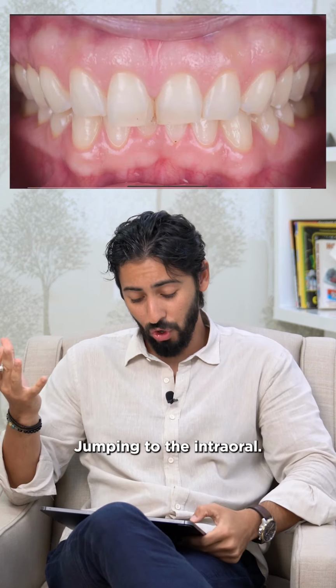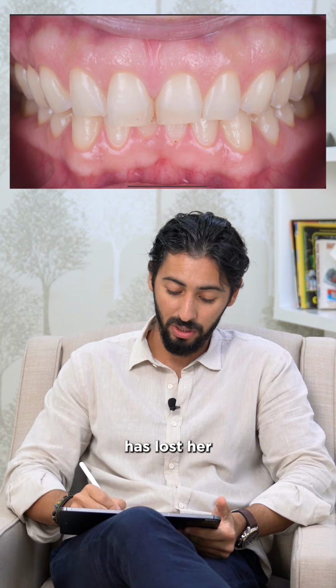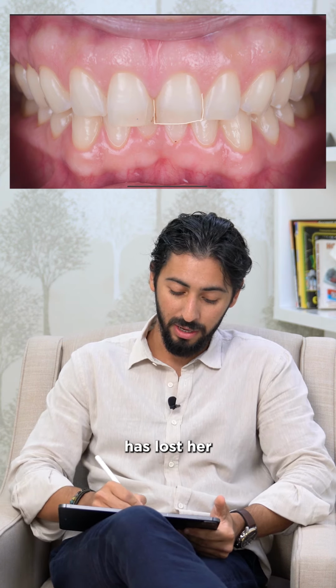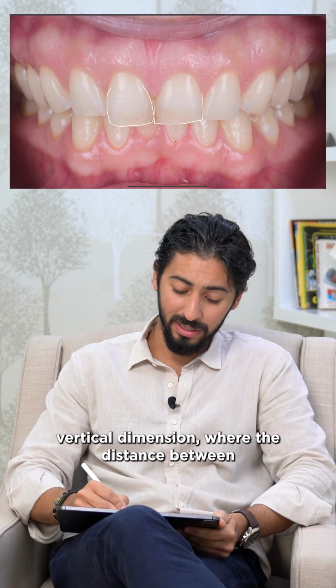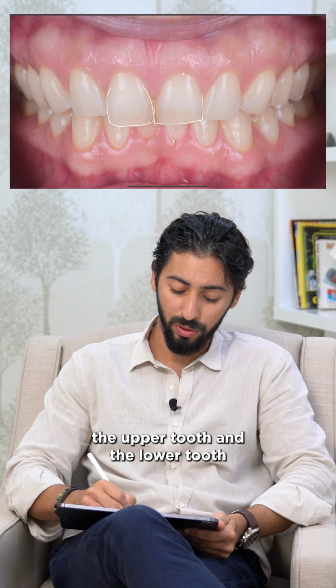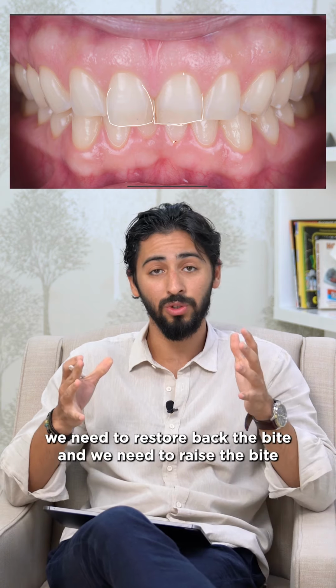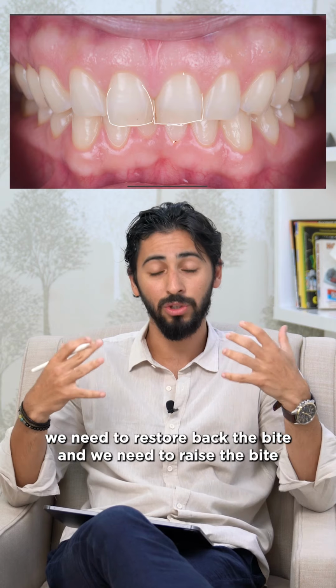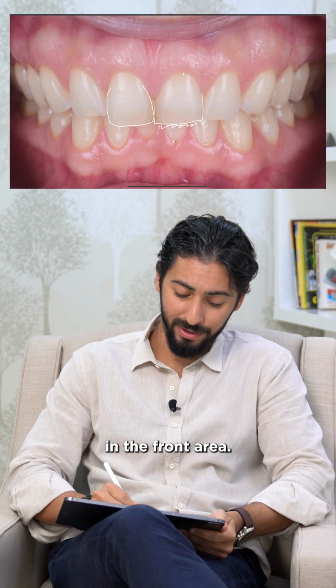Jumping to the intraoral, this is where we can see very clearly that the patient has lost her vertical dimension, what we call the occlusal vertical dimension, where the distance between the upper tooth and the lower tooth is very minimal. Now, in those kinds of cases specifically, we need to restore back the bite and raise the bite so we can gain more space in the front area.